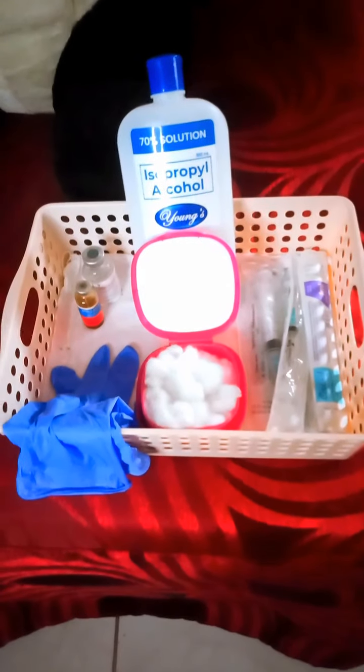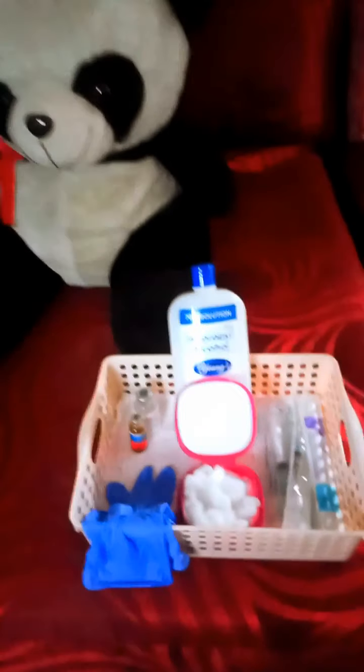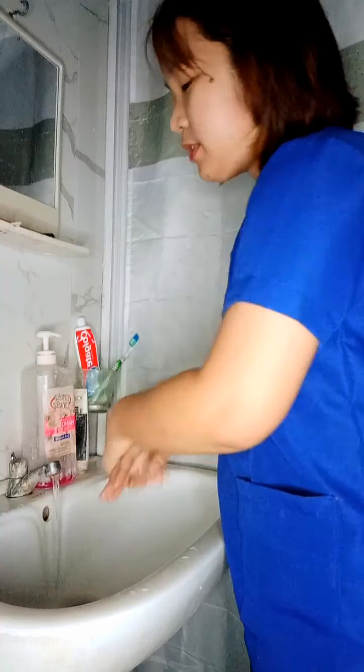The next step for preparation is to assemble the equipment and supplies. We have the medication, the alcohol, the cotton swabs, and the tuberculin syringe that we're going to use for the patient. And the last step for preparation is to check the MAR, or the medication administration record, of the patient. Follow the key. Now we're going to proceed to the second part of administering injection, which is the procedure.